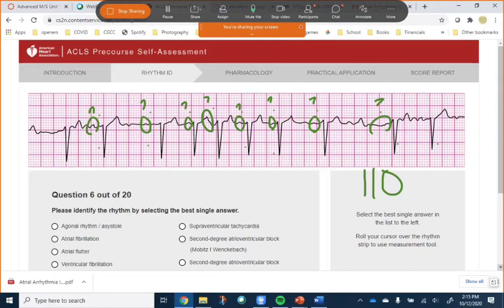So what do you think I want to call this? I think there's something wrong with my P waves, and I think I have a normal narrow QRS. It's normal and narrow. It's irregular. I am going to call it atrial. I'm not going to call it a block because blocks have clear P waves, okay? Clear P waves that I can read. This has no clear P waves. I'm not really even sure if these are good P waves or if they're just too wavy.